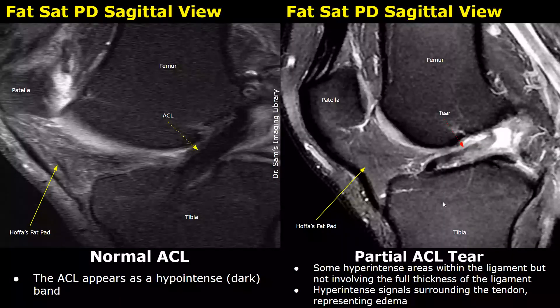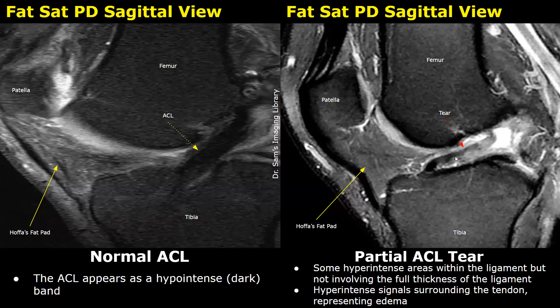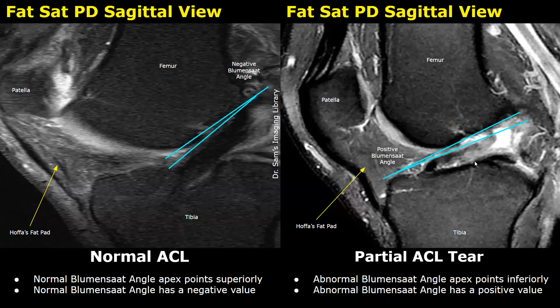Now we will look at partial ACL tear. In this case, some hyperintense areas can be seen within the ligament, but these areas do not involve the full thickness of the ligament — so this will be a partial ACL tear. The ligament is surrounded by hyperintense fluid, which indicates edema. By drawing the lines along the margin of the ACL and the lateral femoral condyle, we find the Blumensat angle apex points inferiorly and has a positive value.